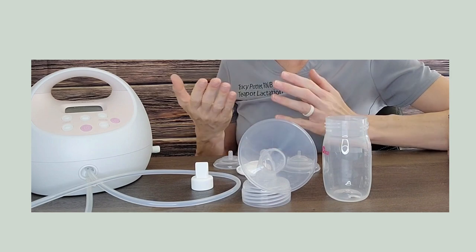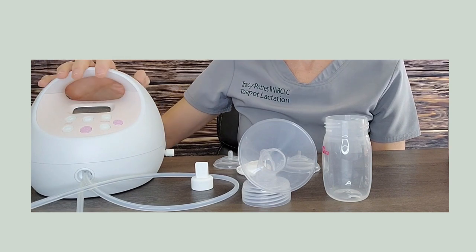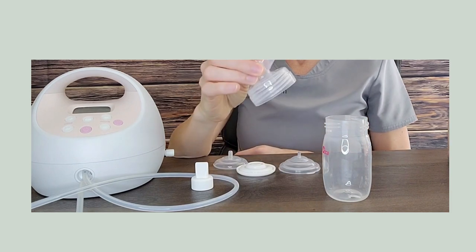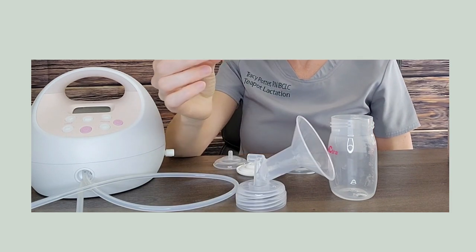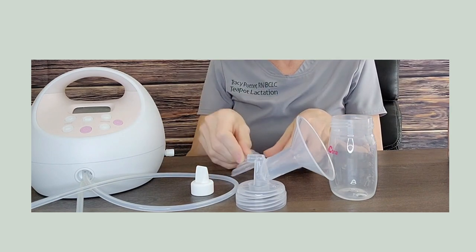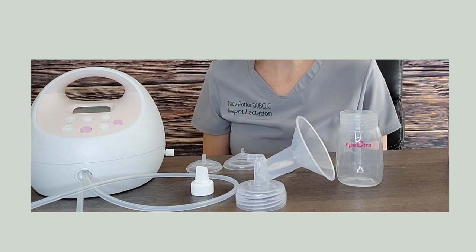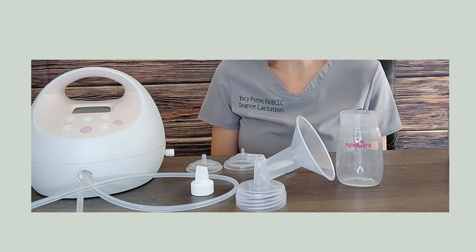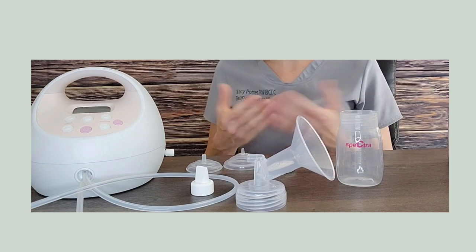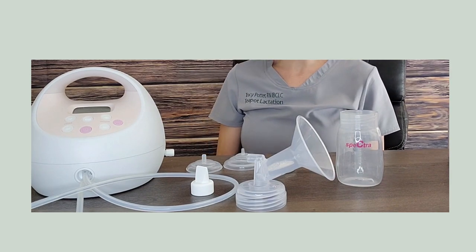Let's start by taking a little tour of all the pieces that come with your breast pump when you purchase it. You have your pump itself — this is the unit with the motor in it — and we'll talk about the buttons in just a moment. Typically it comes with two different sets of flanges, a set of valves, two sets of backflow protectors, and a set of bottles. Each one of these pieces needs to be sterilized prior to first use, and you can do that either by boiling or using a micro-steam bag.